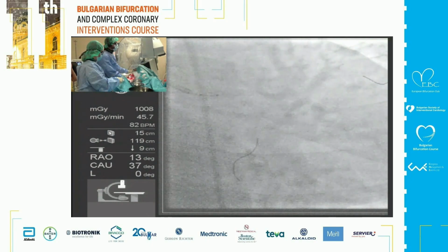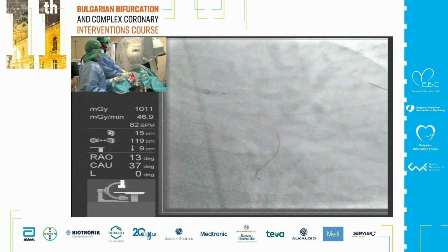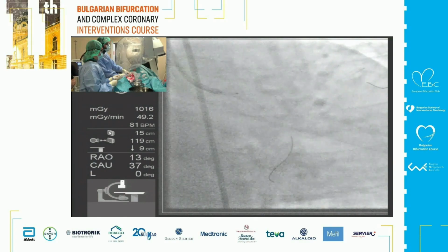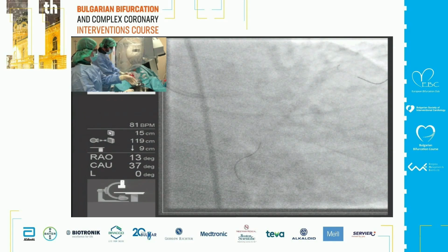Okay. So what I would do now is to put a third wire. I think it's more reasonable. You can do a cine? Yeah, for me too. What I was telling about is that I remove my POT balloon and then try to pull my side branch wire just to see if it moves easily or if it is the stent.